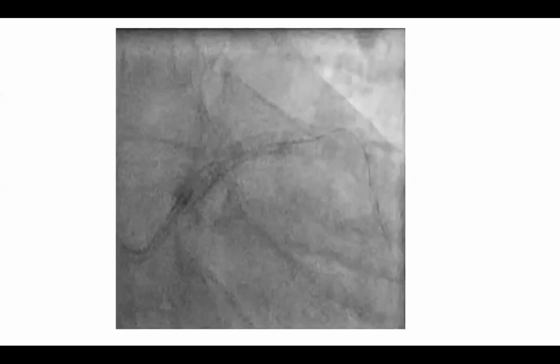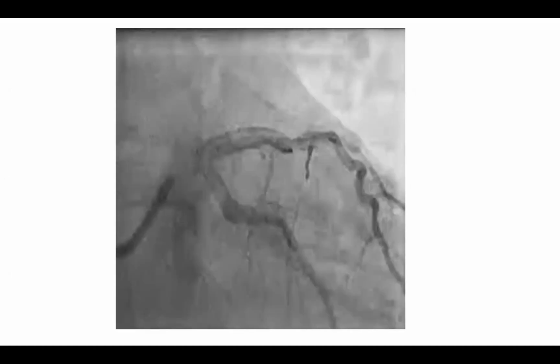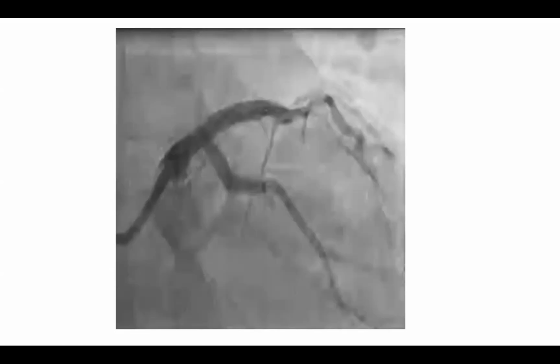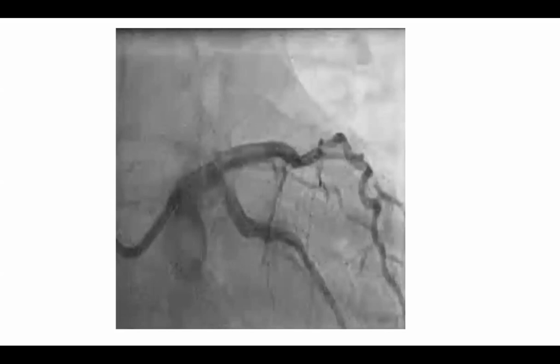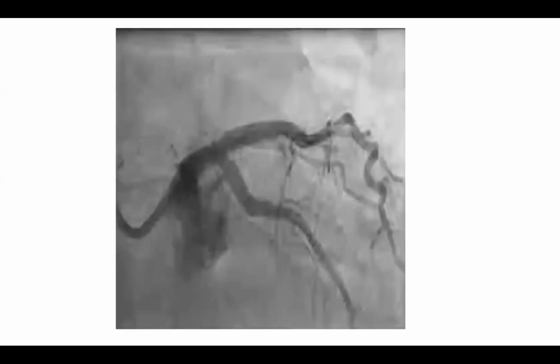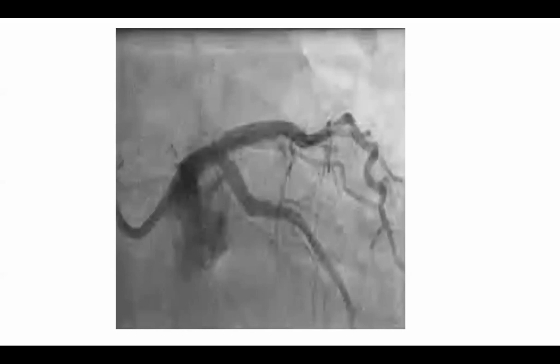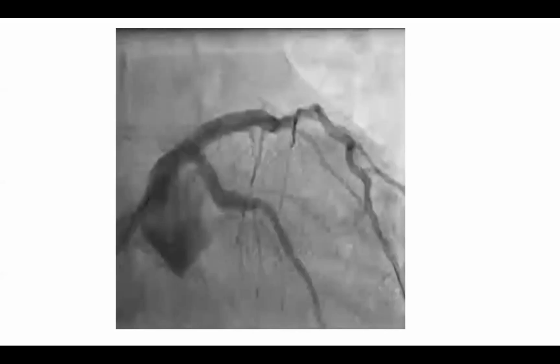Did you use intravascular imaging at any stage in this case? We used IVUS. Okay, that's fine. I think that's the right sequence of what he has demonstrated, and what Dr. Tariq also said, that if you have done sequential 1-to-1 at high pressure, then you don't need to go with the kissing balloon at very high pressure. You have got your apposition with the sequential high pressure ballooning, and then with your kiss, you are just restoring the geometry.